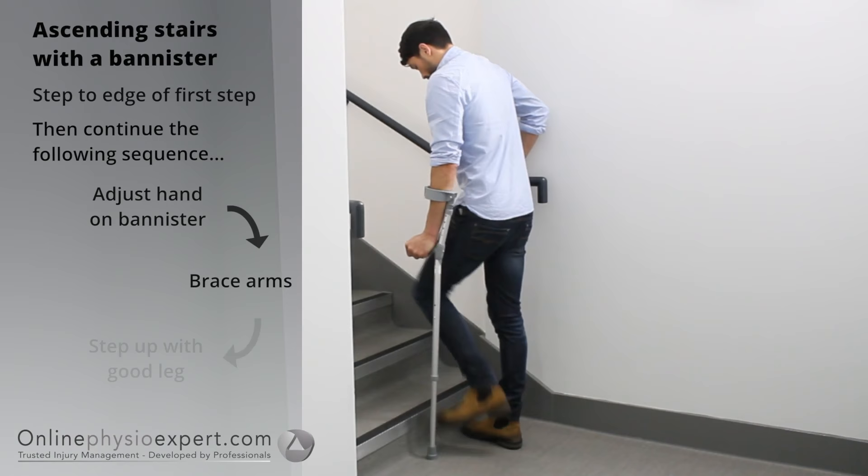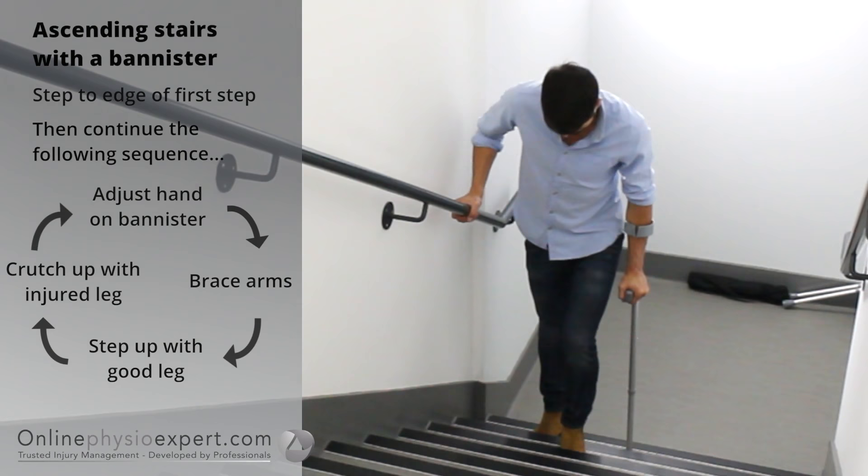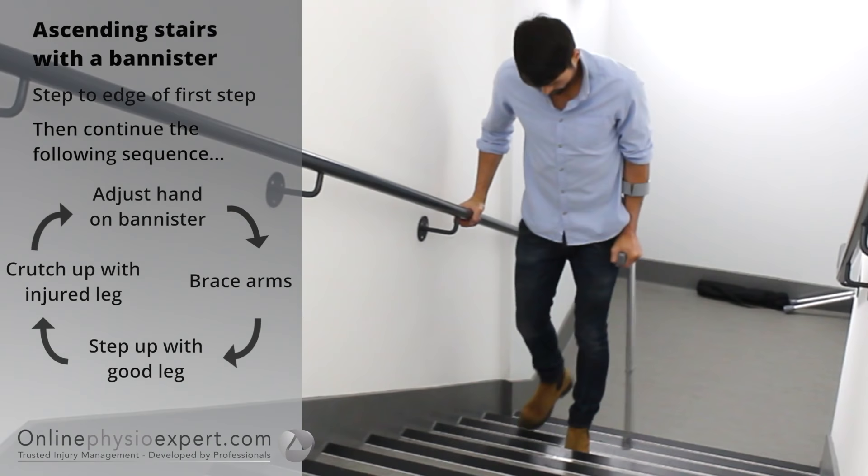To ascend stairs safely, step your feet to the edge of the first step. Place your hand forwards on the banister. Step your non-injured leg to the next step followed by your injured leg with the crutch. Repeat these sequence of movements until you safely reach the landing.